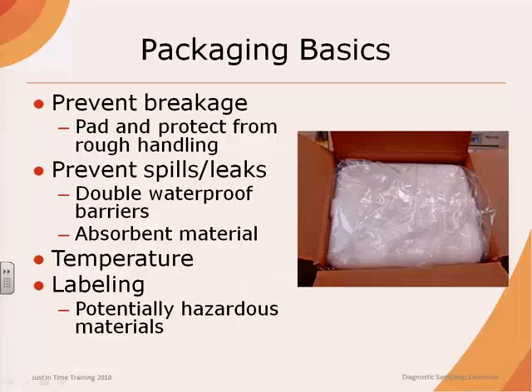Preventing spills or leaks is particularly important given the potentially infectious nature of some samples during an animal disease emergency. In order to be of diagnostic value, samples must also be protected from extreme heat or cold, and some samples require refrigeration or freezing. Finally, the package must be labeled appropriately to alert shippers to the nature of its contents and to provide contact information for the diagnostic laboratory.